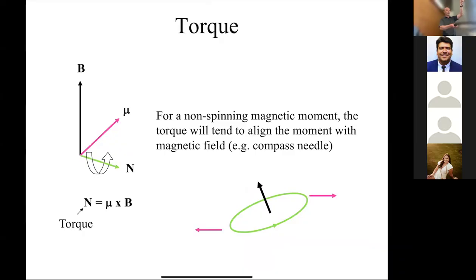Now I'm going to put it into an intermediate energy state, and I'm just going to spin it. And now it's precessing. This is fundamental to MRI, that the spins are going to precess around the main field. So that's essentially the concept you need to have in mind.